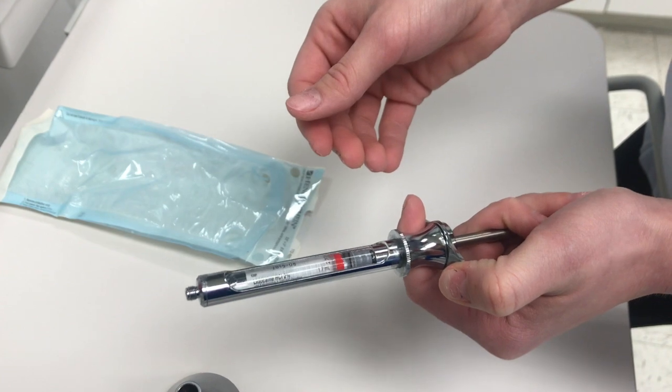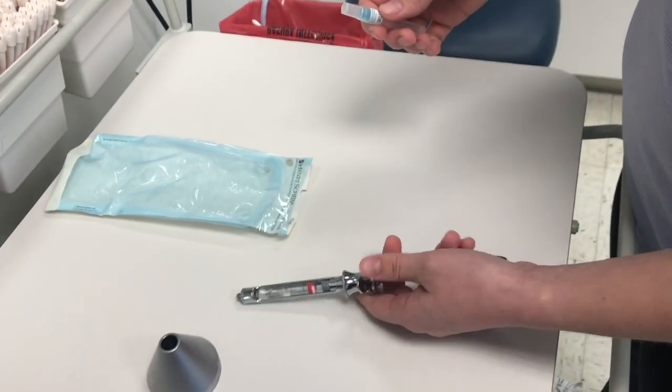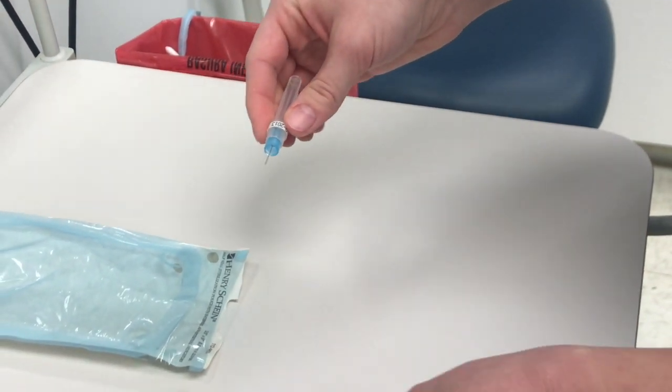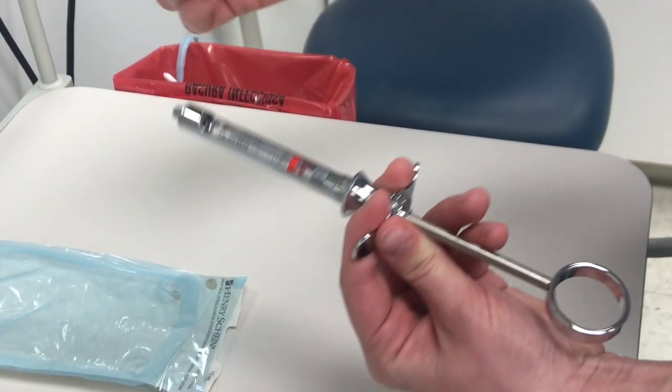When the cartridge is in place, push the piston rod into the rubber stopper. Remove the protective plastic cap from the needle, screw and press the needle into the syringe.